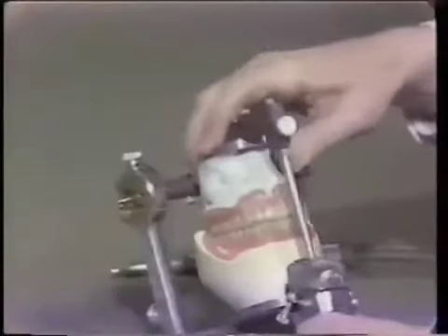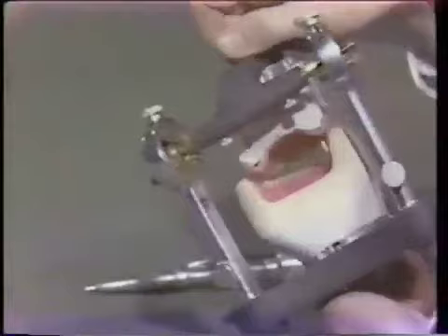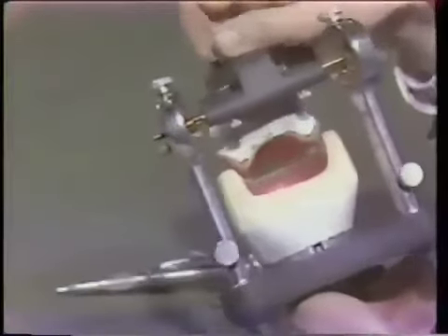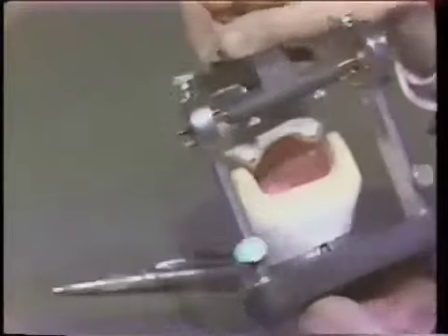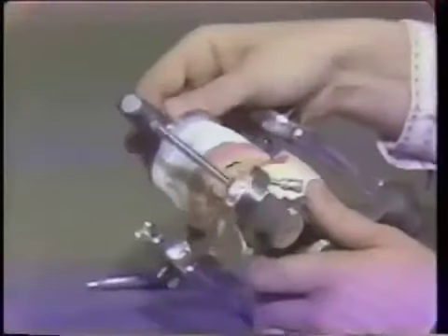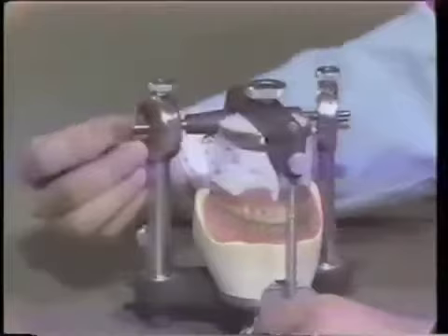Once again we close. It feels very solid — there's a definite solid sound when these tap very lightly together. If you're hitting one or two teeth initially, you'll know you're nowhere near your ultimate goal. So let's consider the adjustment complete for centric occlusion.